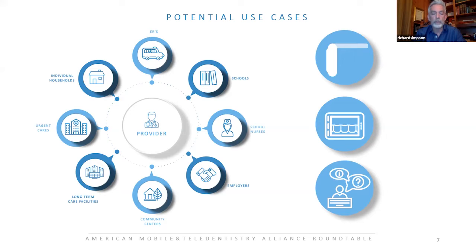And being able to capture images in these facilities, oftentimes you're not allowed to use Wi-Fi while you're there. You don't have to have that with this system. You can capture and store and then manage those images later on. And so there's a great advantage in being able to do that.